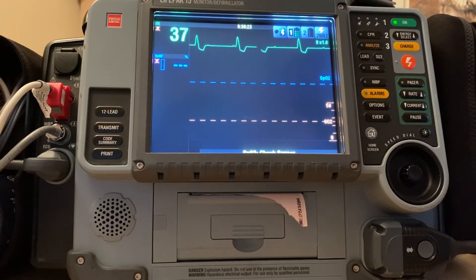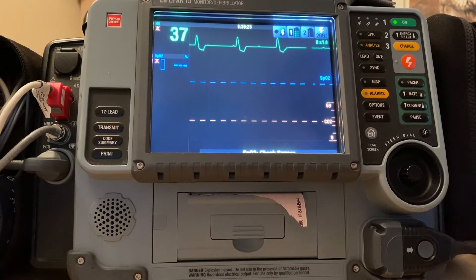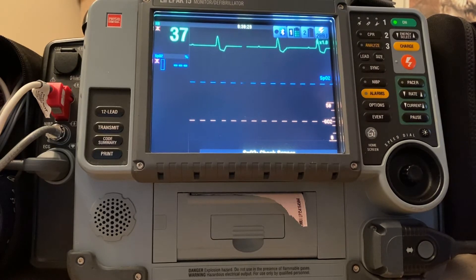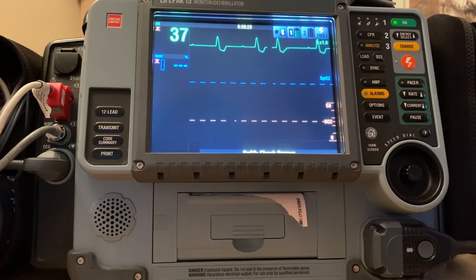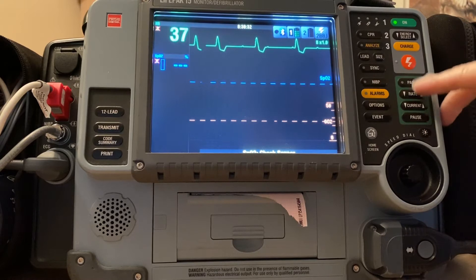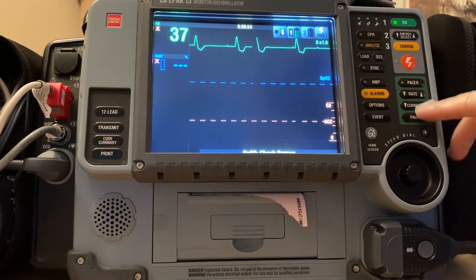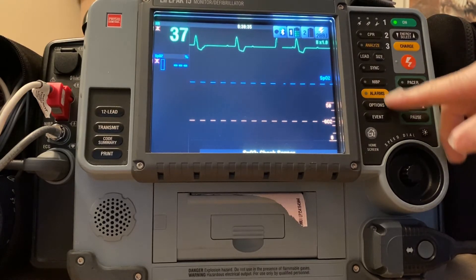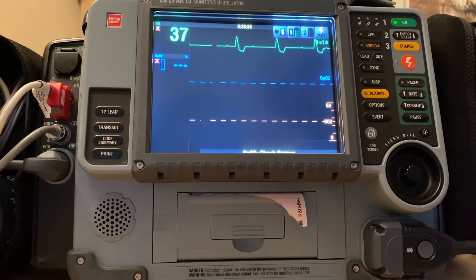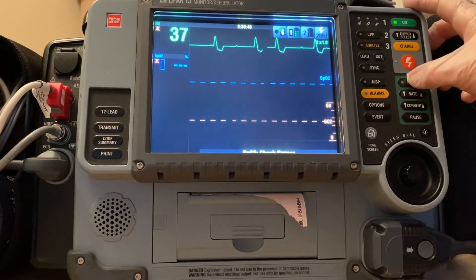If I have time and if the patient's condition allows it, I'm going to ask my partner to draw up some analgesic. I am going to come down to the pacer — all the pacing controls on the cardiac monitor here are nicely placed in this green box, and we just go from top to bottom to accomplish it.